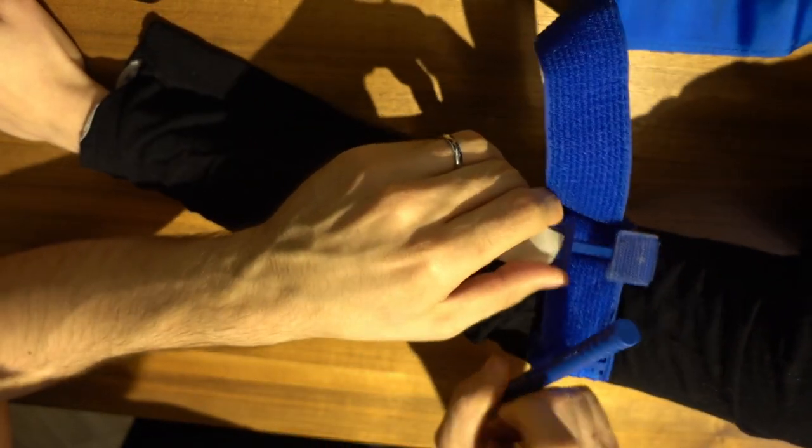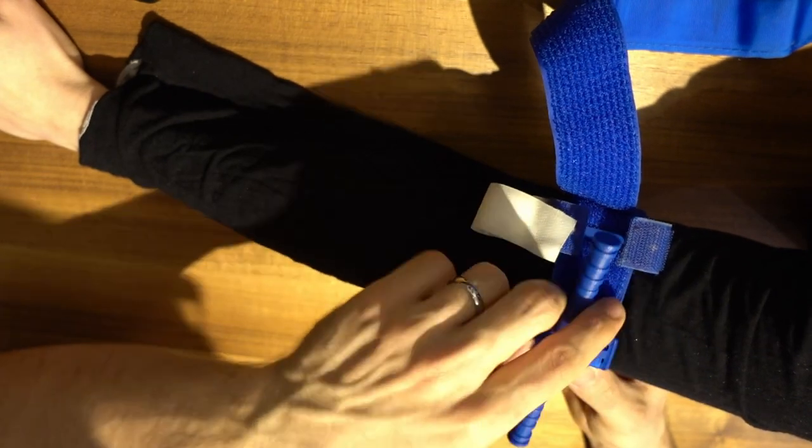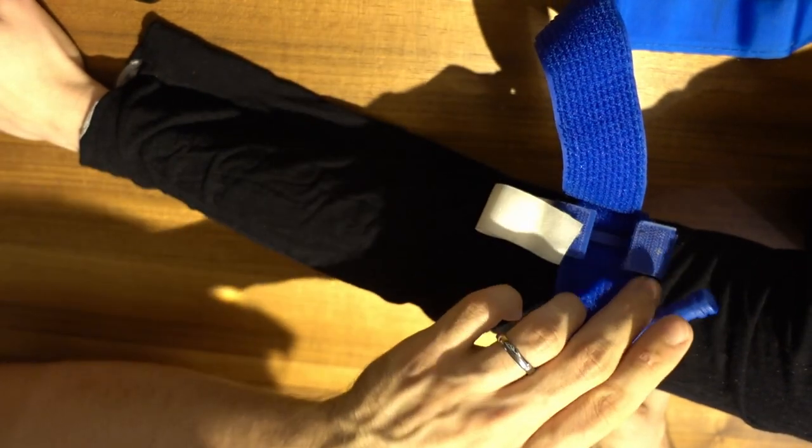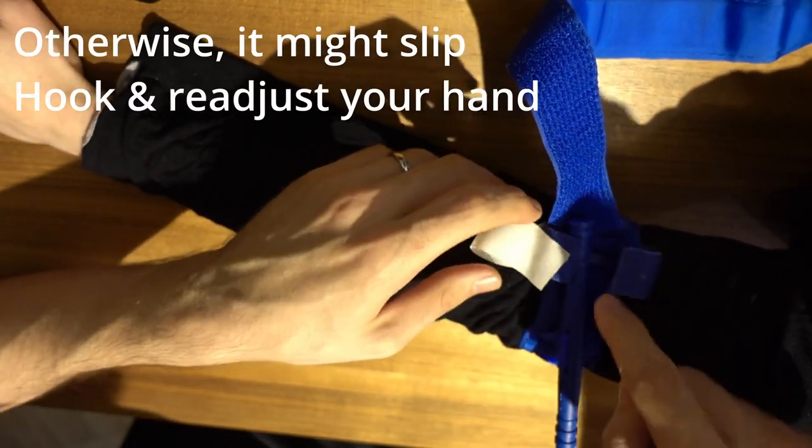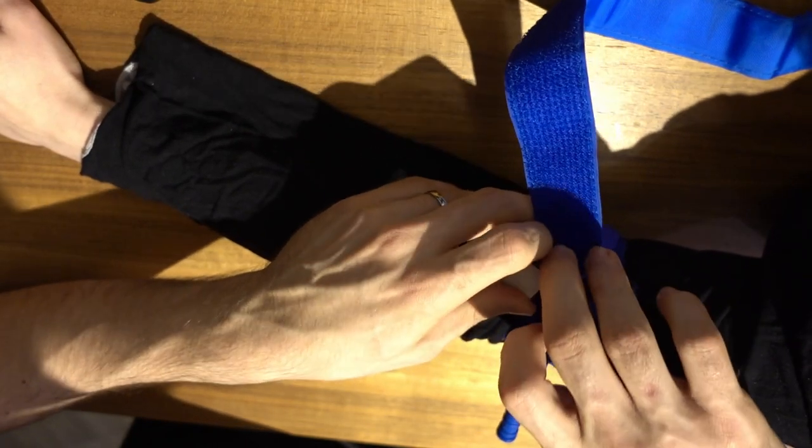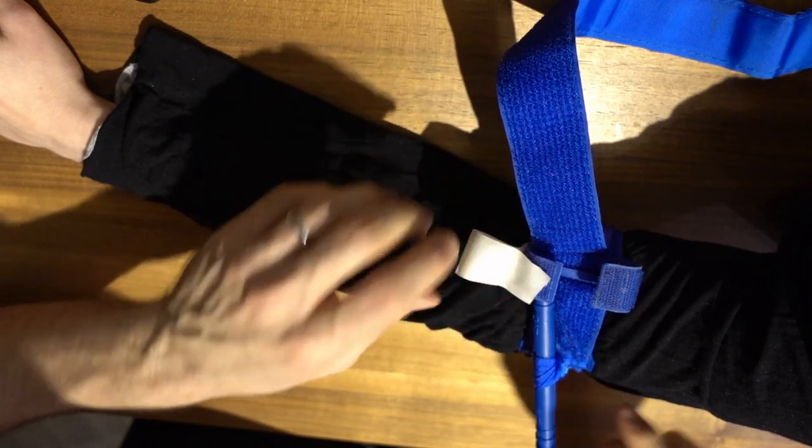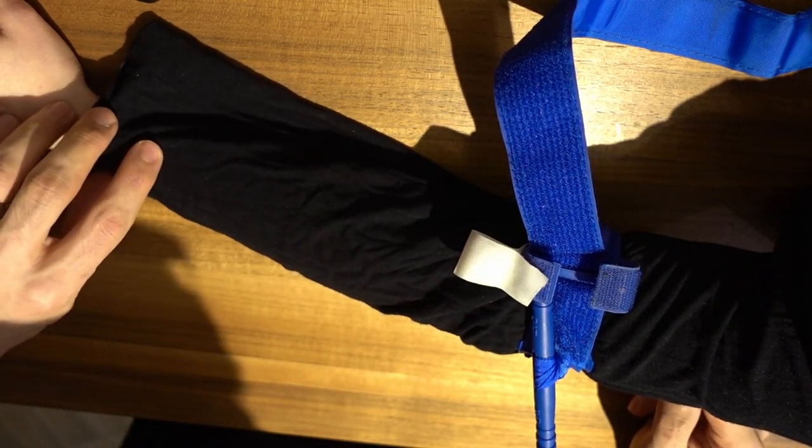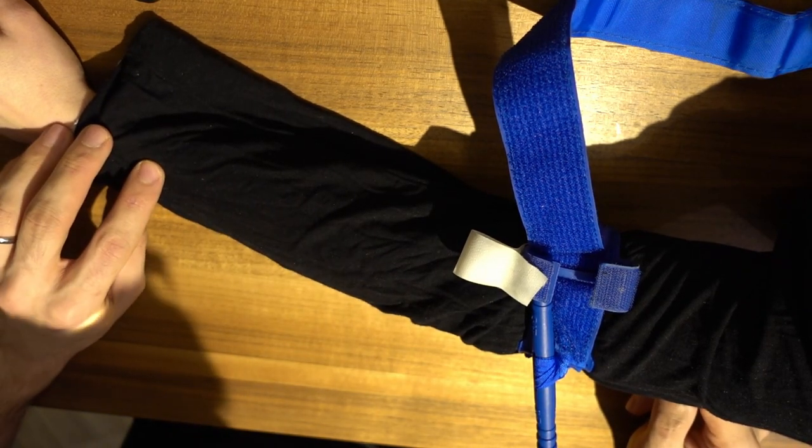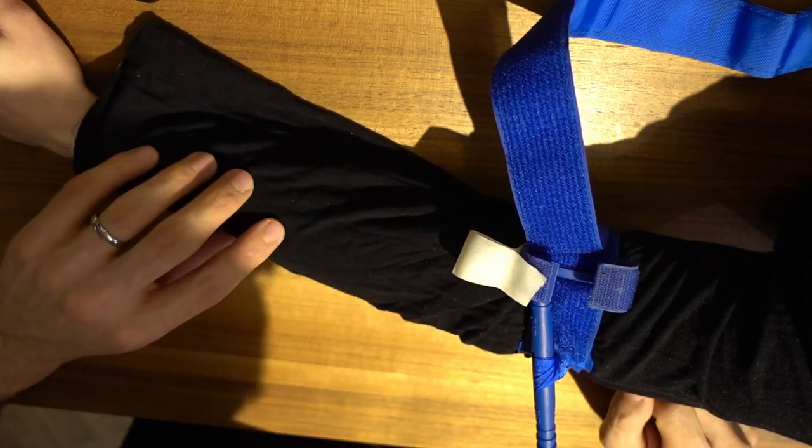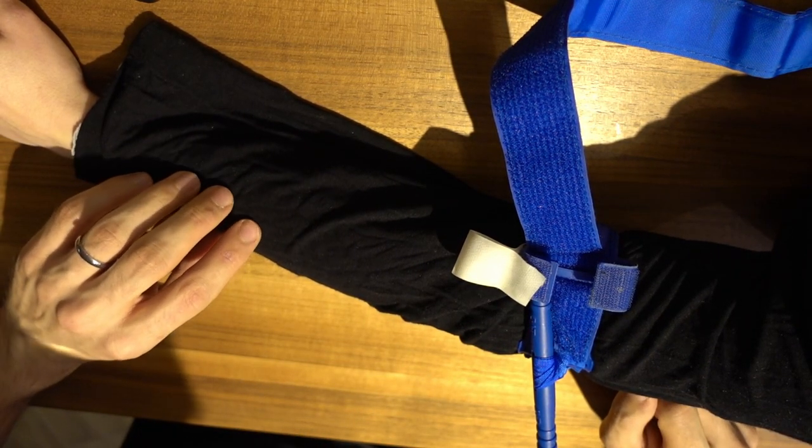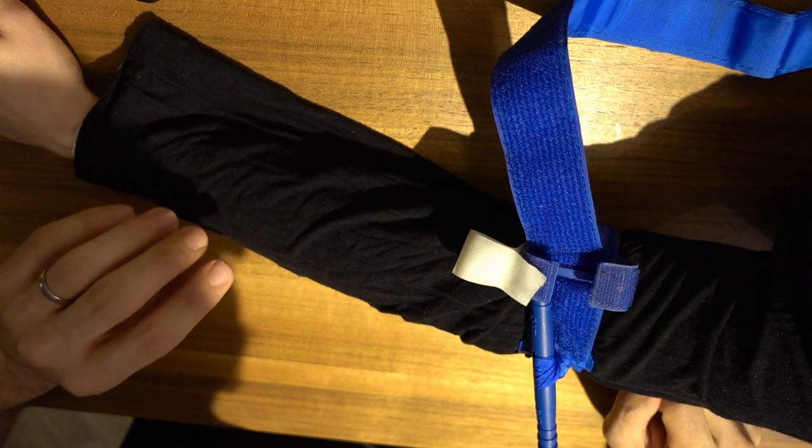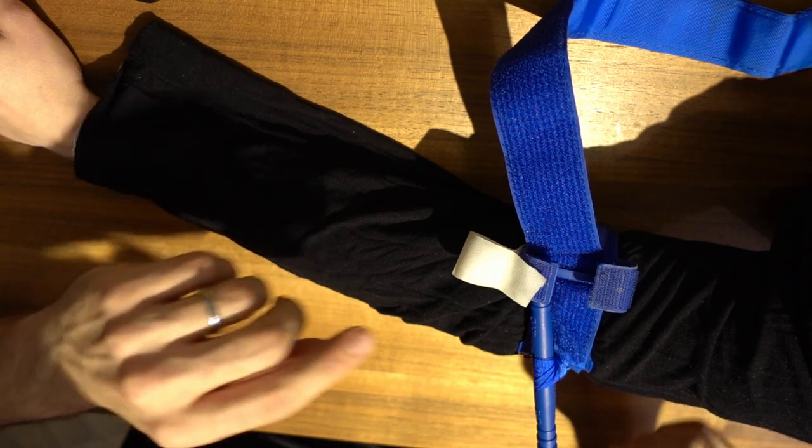Now you're gonna get this windlass here and you're gonna turn it. It doesn't matter if it's clockwise or counterclockwise. You just have to start turning it slowly. Then you can hook it here to adjust it again. Rotate your arm, rotate again. Now probably on the second rotation it should start hurting. You'll feel your arm tingling, and the third or fourth rotation is required to actually fully constrict the blood flow. It can hurt and people will complain or they will scream at you and they will beg you to take it off. But you don't want to take it off. It's better than bleeding out in the end.